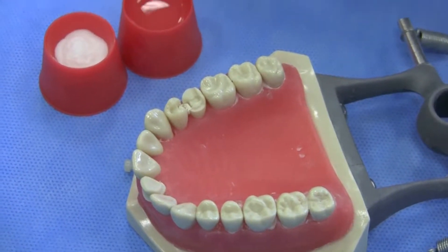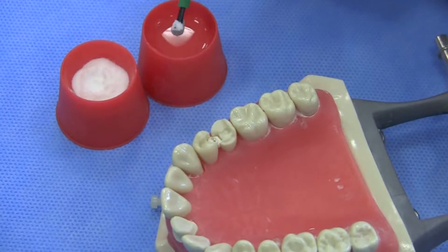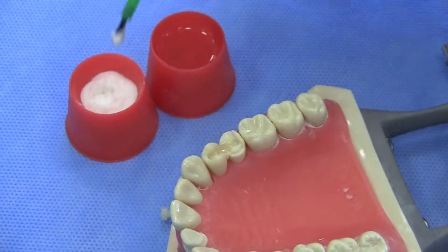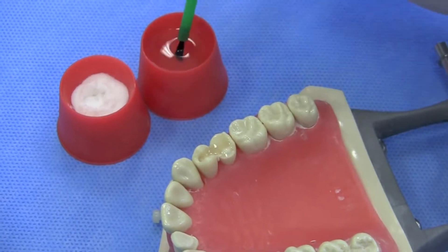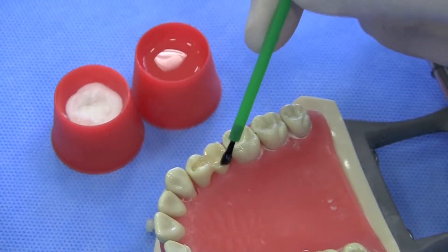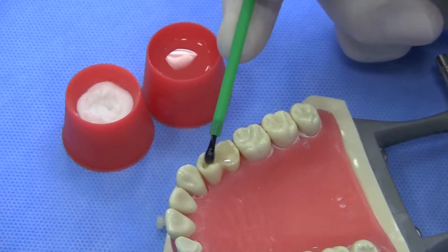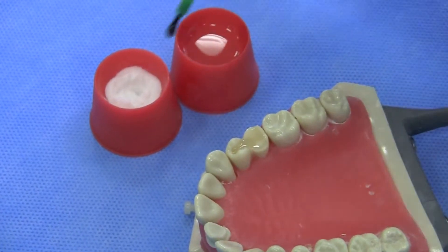It's a very quick process. Take the brush, dip it in the monomer, pick up some of the powder, then return to the monomer for a quick dip. The product is then placed into the cavities. Go back, pick up more Duraceal, and wipe it on — filling up the holes first, then covering over the surfaces, and intentionally adding more product to the interproximal areas, covering the enamel margins. This actually helps protect the enamel margins, and we don't have issues with fracturing of the delicate enamel margins. In the case of an onlay, that marginal ridge might be prone to fracture.